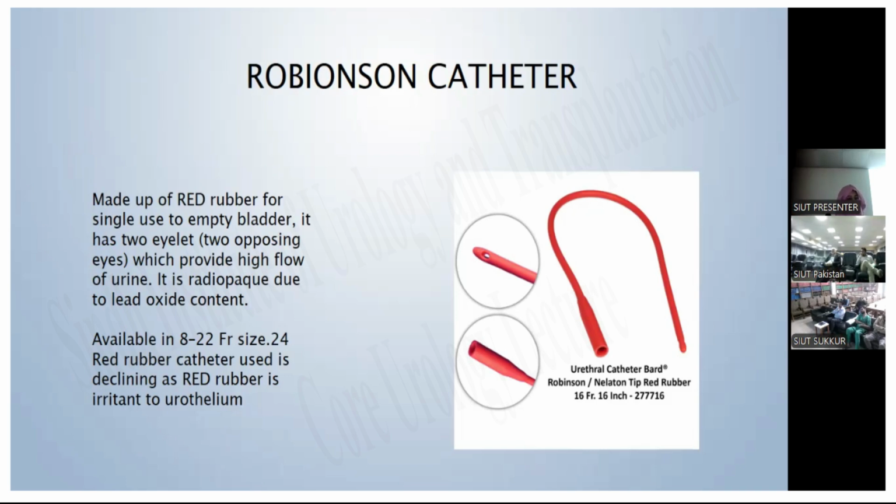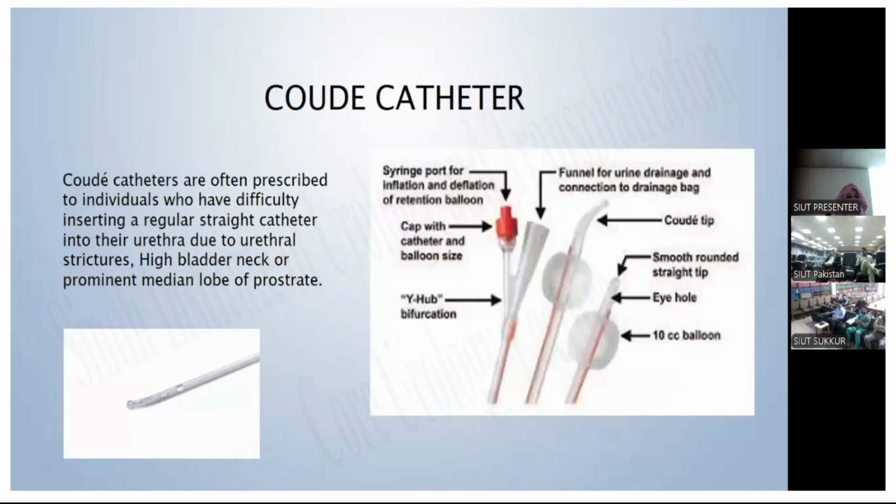Just because the red rubber catheter has a kind of property which increases friction, which increases encrustation, which increases infection. So it was replaced with another coating, and that coating is latex. Okay, we will discuss further in more detail later.